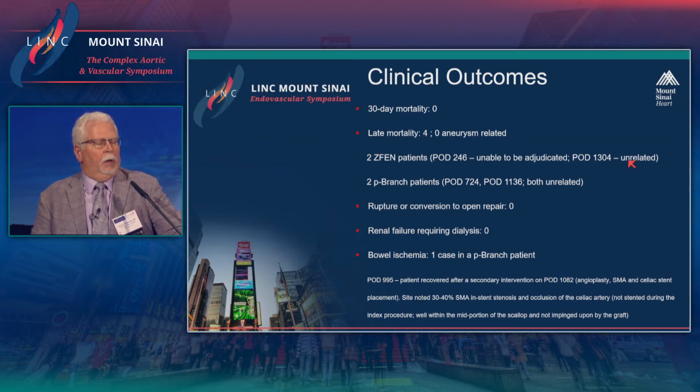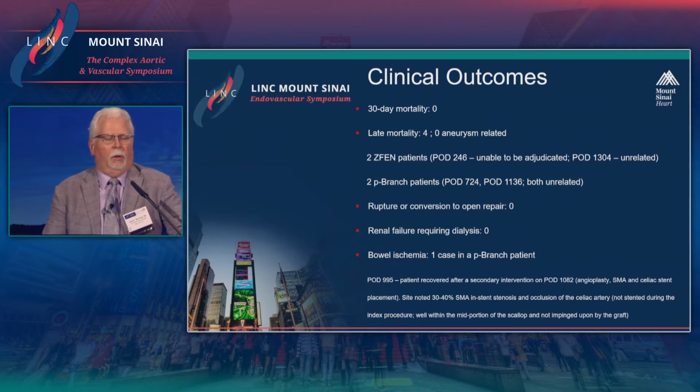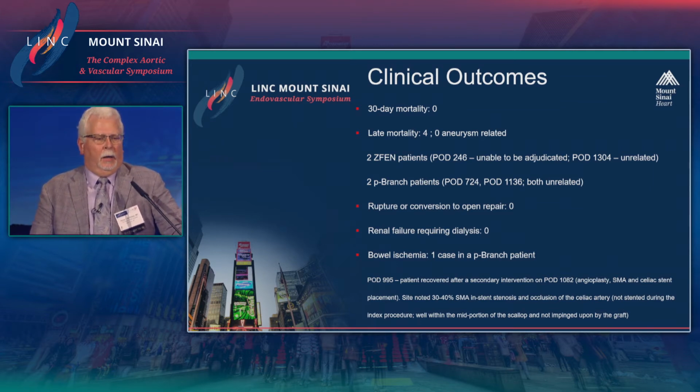He ended up with a pneumonia, which he had high fevers, which he did not seek medical therapy for about 5-7 days. And then on his follow-up CT scan at about 4.5 years, we found gas within the aneurysm sac, and he ended up with an infected aneurysm. We were able to go in and we explanted it, but he had a very protracted course and went to palliative care about 6 months after his explant.